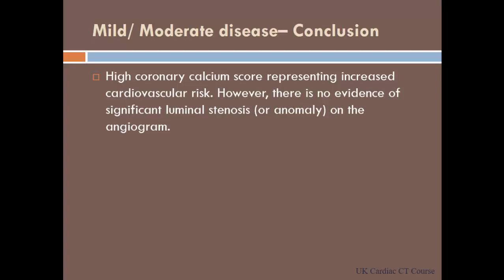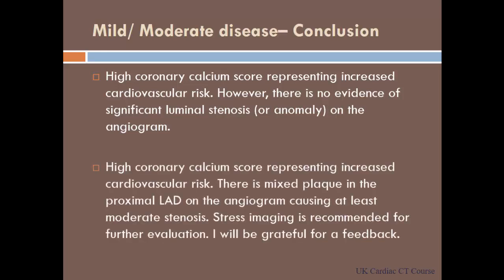That second sentence is from the angiography part of the data. And a third could be like this. High coronary calcium score representing increased risk. Then there is a mixed plaque in the proximal LAD on the angiogram causing at least moderate stenosis. Stress imaging is recommended for further evaluation. And you will be grateful for feedback.